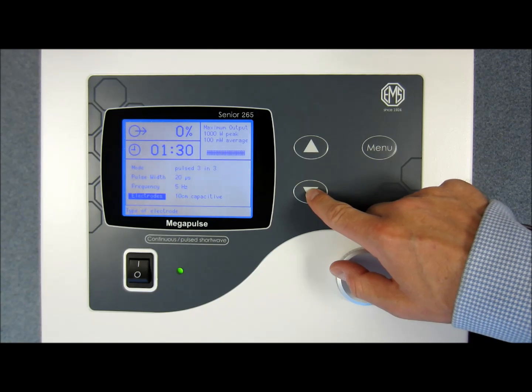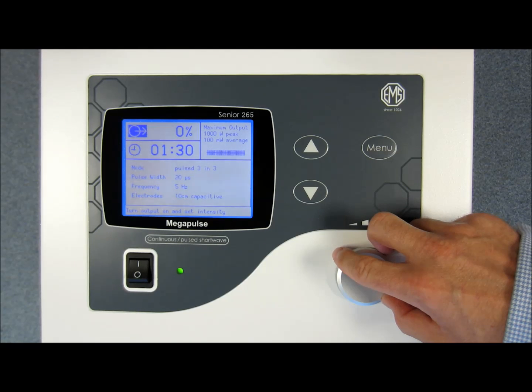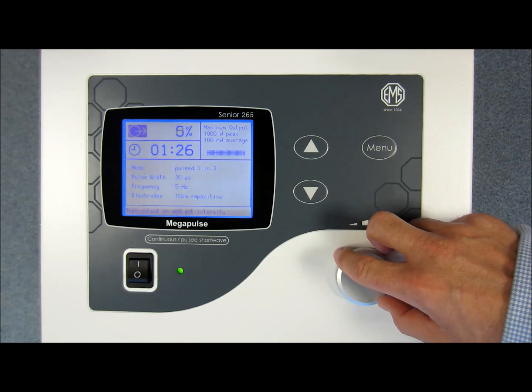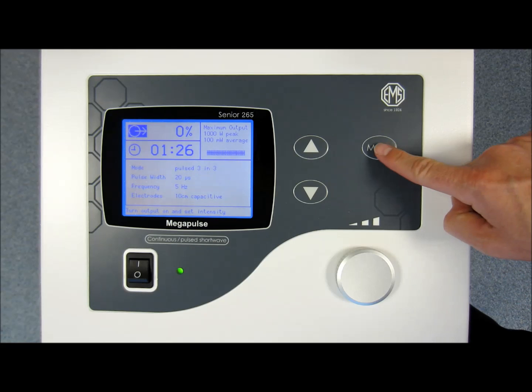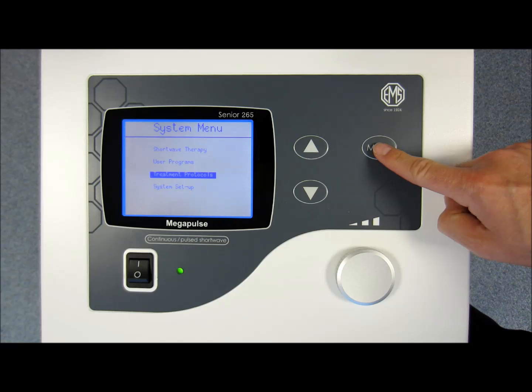Finally, move the cursor up to the output at the top of the screen, and now you're ready to start treatment. Simply turn the dial to the desired output once the electrodes are in place. A new and beneficial feature of the Megapulse Senior is that you can apply the correct settings according to the type of injury you wish to treat.